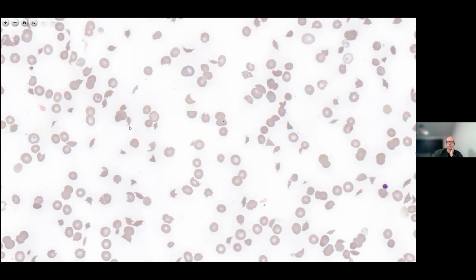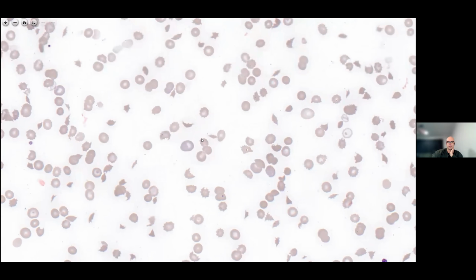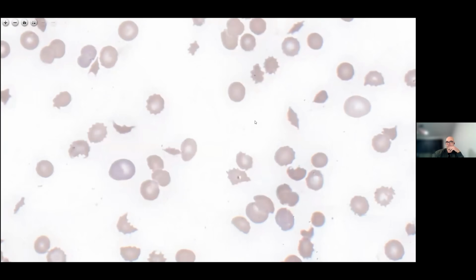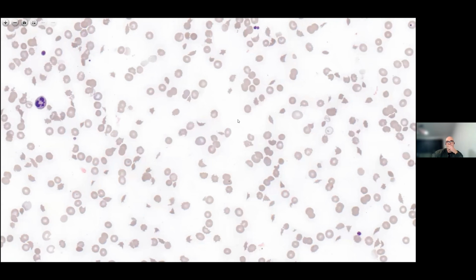I don't know if I could just give my comments on the clinical side of it. You see a film like this, and it needs to be actioned straight away, and the team looking after the patient needs to be contacted, because the differential diagnosis is so wide and you have to correlate it with the clinical picture. There could be things like, as you've already mentioned, DIC, TTP, HUS, even preeclampsia can cause this.